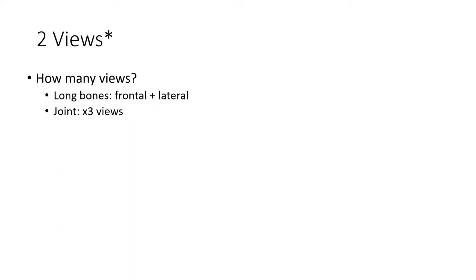So let's delve into these asterisks I had, these two views. How many views are necessary? Well, this is from EM Cases, and there might be some differences at your local hospital, but for long bones, usually we need a frontal and a lateral. In joints, we usually need three views, with an oblique usually. In hands, wrists, and feet, you'll need a frontal, oblique, and lateral as well.